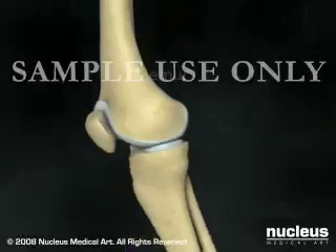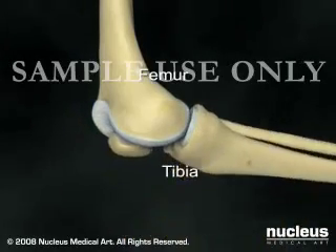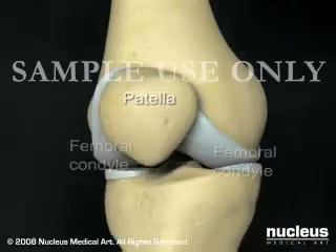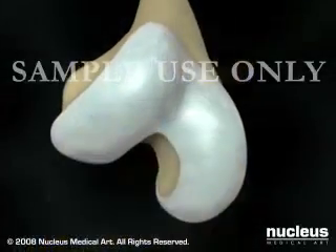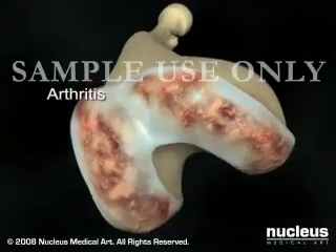Your knee joint is made up of the lower end of the femur, which hinges on the upper end of the tibia, and the patella, or kneecap, which slides along the groove formed by the femoral condyles. Total knee replacement surgery is a procedure in which a painful or poorly functioning knee is replaced with artificial components.